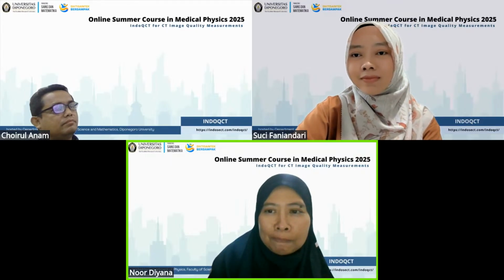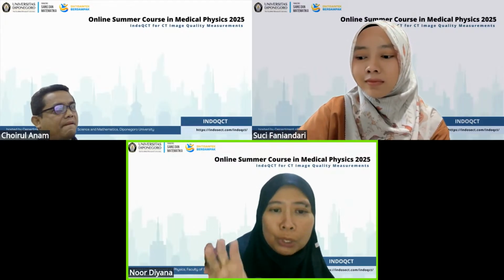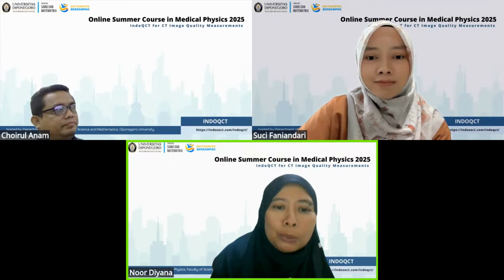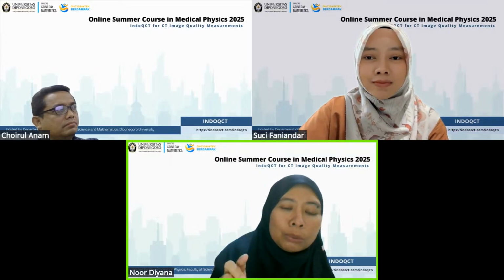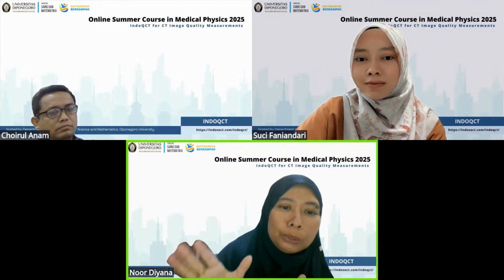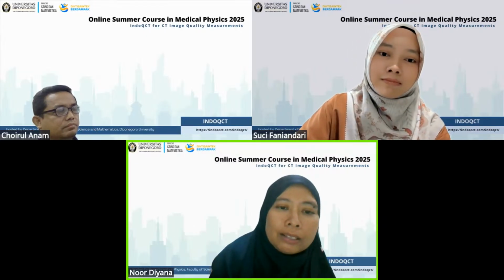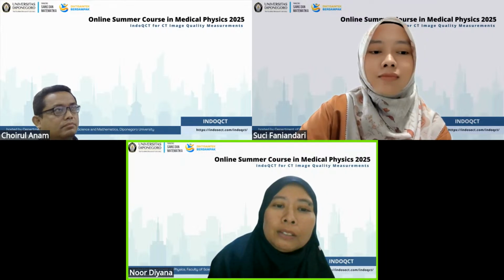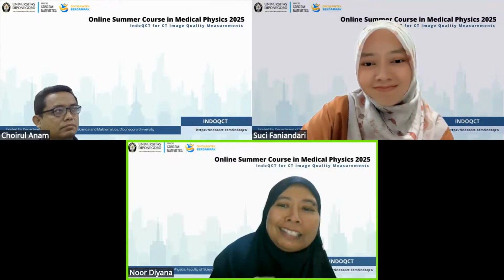So it depends, and also it depends on the monitor that you use to visualize your image. That's why in CT, in clinical practice, you also have to test the monitor that you use to visualize. You have a specific test for the monitor also. So it is more subjective. To answer your question, it is subjective.